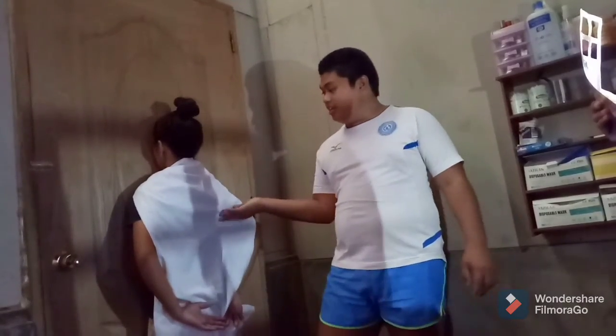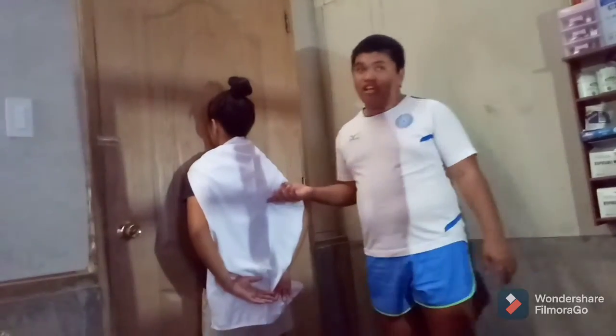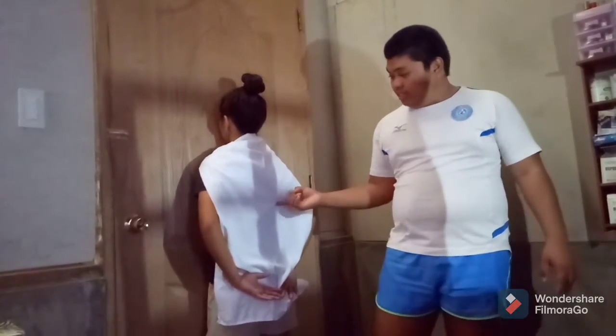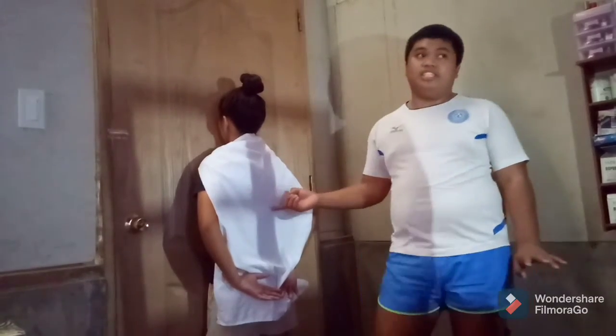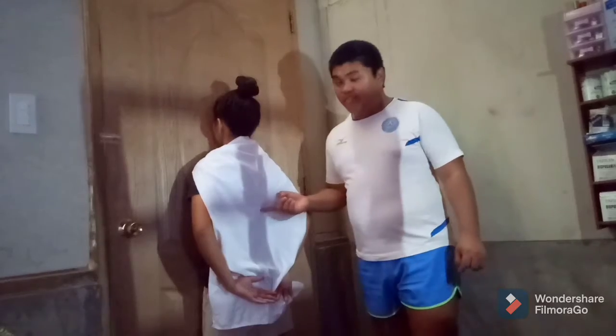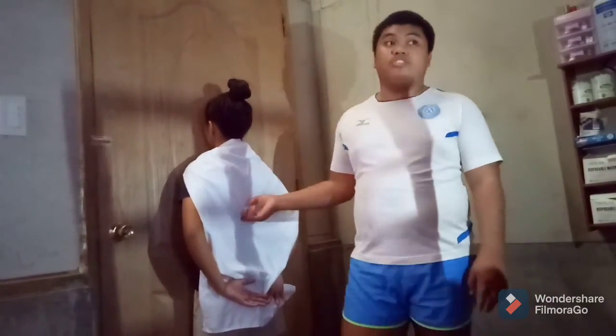So, this is the inferior angle of the scapula. So, you need to center it, since the thoracic 7 and this inferior angle of the scapula are at the same level, so the central ray must be perpendicular to the thoracic 7.